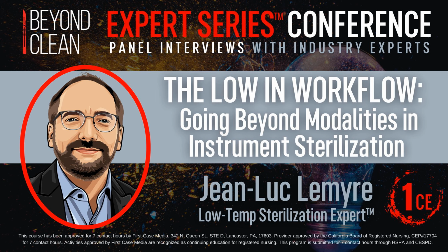Sure. So before we move on and start talking about the future of this topic and the exciting things going on in the industry, I wanted to talk about the tail end of that cycle that you described, that evacuation process, because as we mentioned, at the concentrations that we're using, hydrogen peroxide is very reactive and very dangerous. It's meant to kill living organisms, and we are living organisms, and so we don't want that.